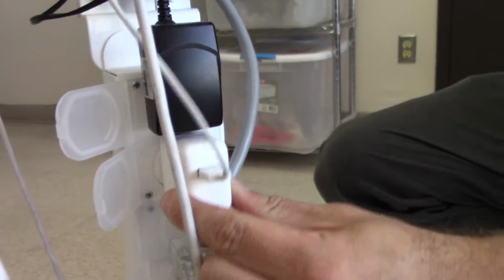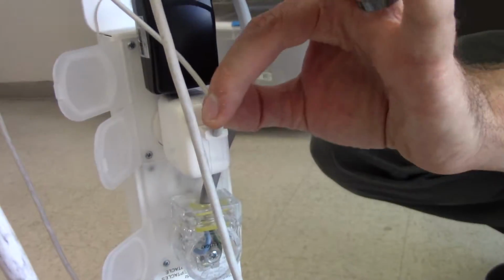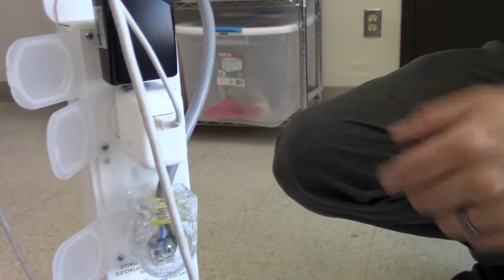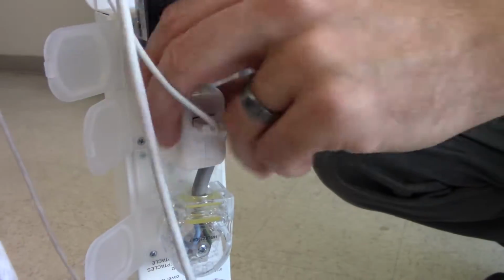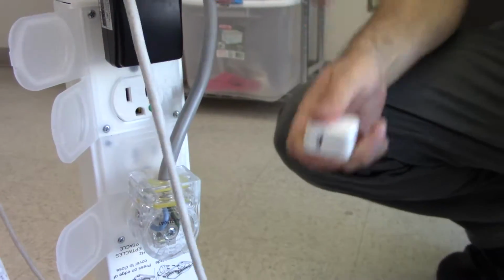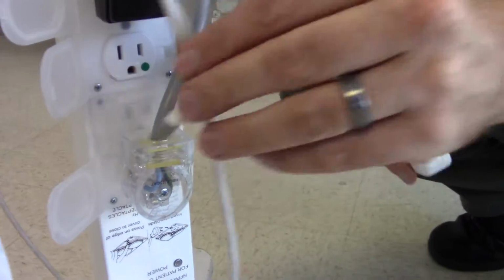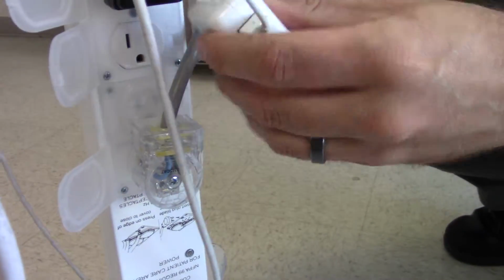And so you can see where this is just a standard Apple charging brick. Once again, this is sitting at a pretty severe angle. And so it wears out quite a bit there. It's also prone to just being stolen because all you have to do is, oh, cool, now I have an Apple charger, which are what, exactly, 15 or 20 bucks? $15 Apple charger, yeah. Nice. For free.